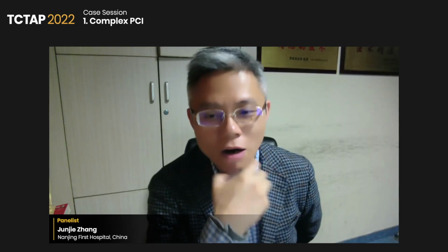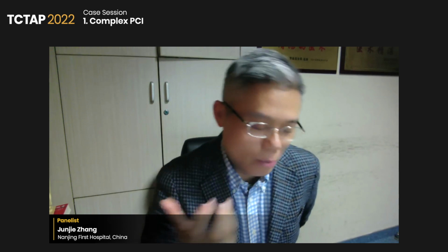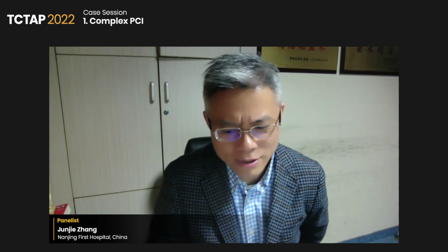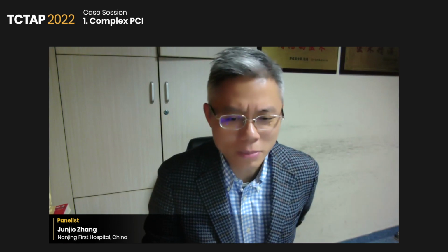Yeah, please, John. For this case, we have also met some similar cases, especially when doing structural heart disease procedures like TAVI with large sheath sizes, where sometimes we use 2 ProGlide. There will be, I think, a 6 to 8 percent rate of failure when we use ProGlide.